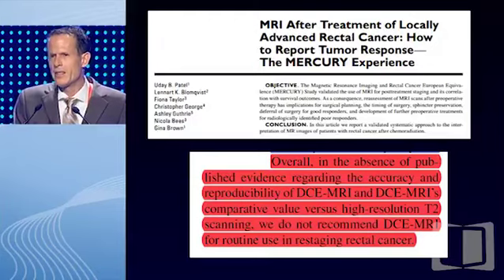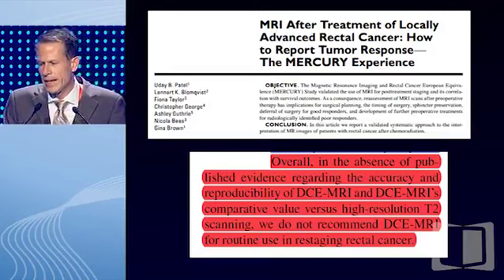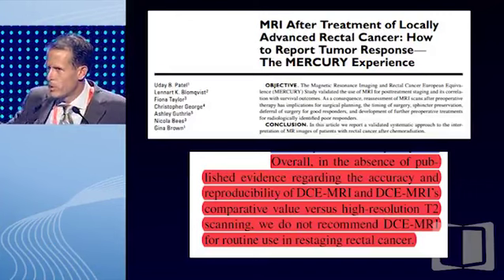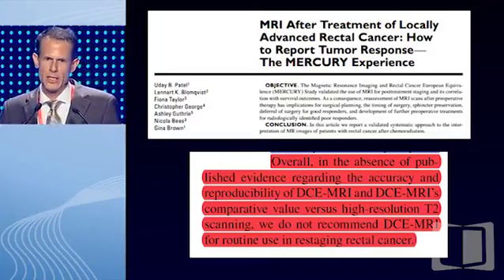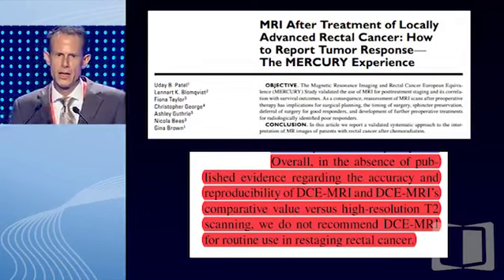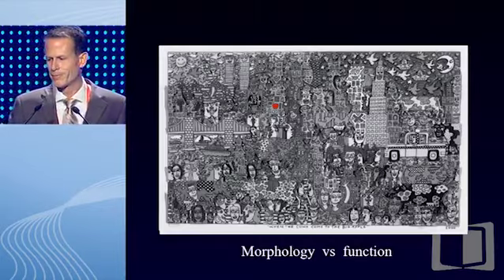Again, can everyone do this? I don't think so. It's, again, quite complex and quite complicated, whereas DWI is really straightforward. And this is also underlined by this study saying that perfusion MRI should not be included in every clinical situation and in every trial.